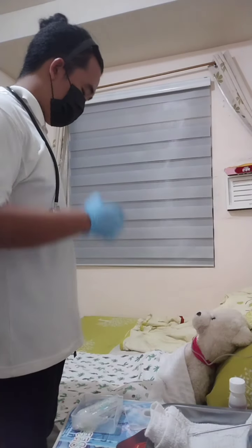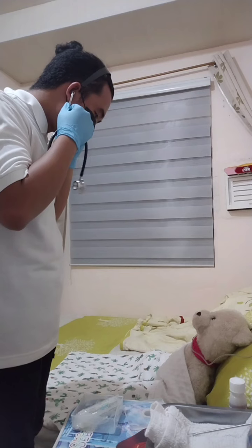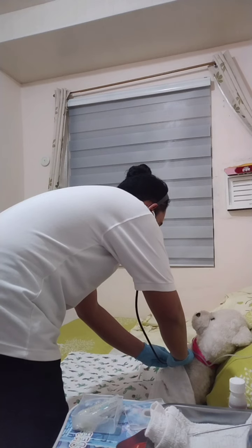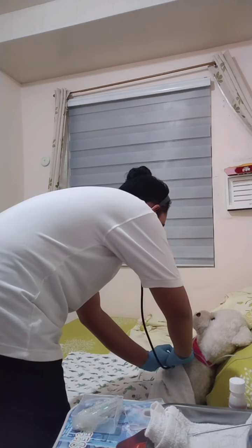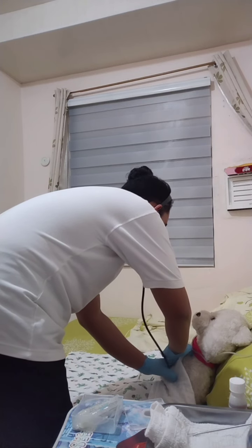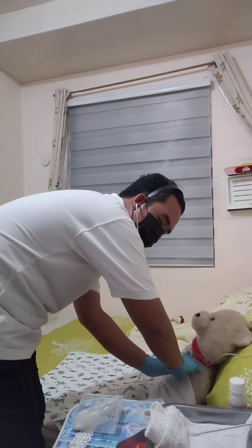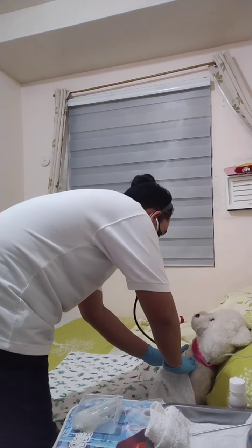Determine tube placement. Aspirate gastric contents to check for gastric residual. Return aspirated contents to the stomach unless the volume exceeds 150 ml. Presence of gastric secretions indicates that the distal end of the tube is in the stomach. Residual volume indicates if gastric emptying is delayed. Delayed gastric emptying may be reflected by 150 ml or more remaining in the client's stomach.